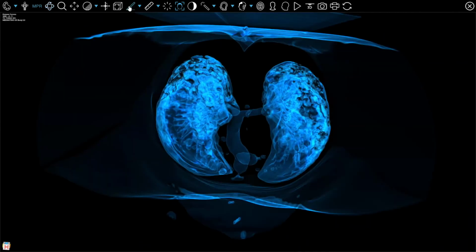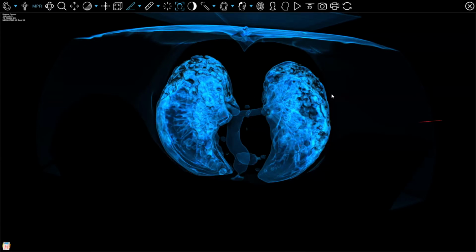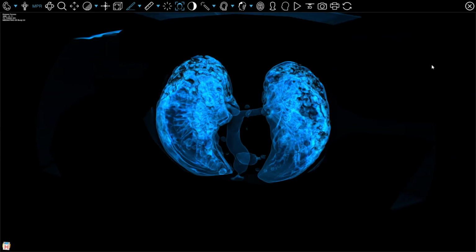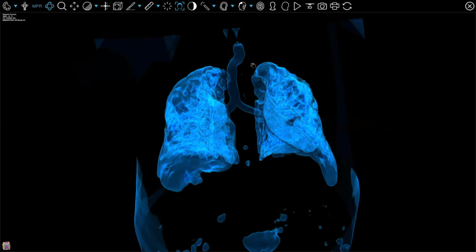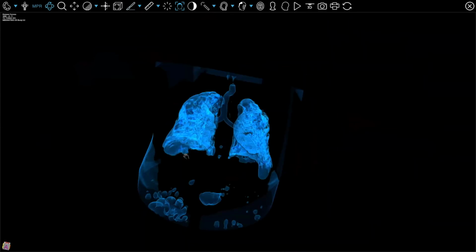And this can be used, as I said, for evaluation of patients. So just imagine you have this solution already integrated in the hospital system. So you automatically upload all the information to the system. Then you can have the presets and do a full evaluation of the lungs.